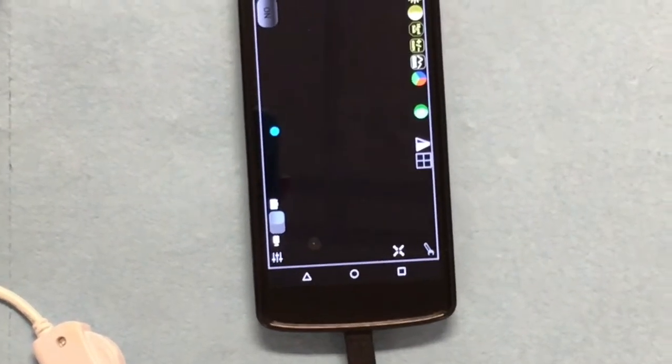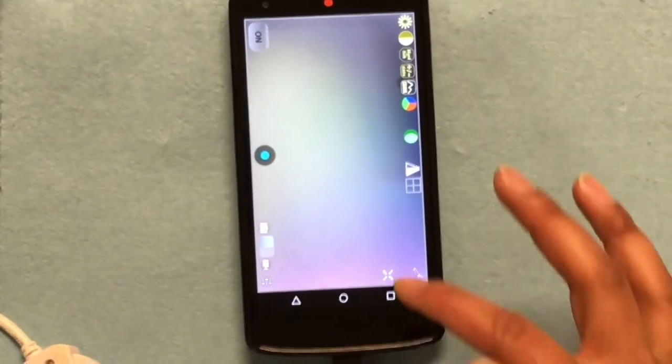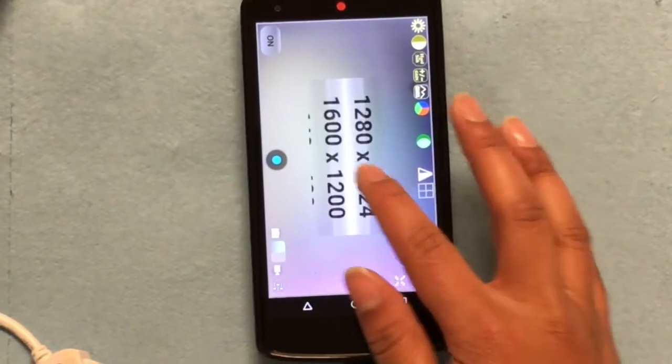Now, set the resolution by clicking on the resolution icon, which looks like an X. Select the highest resolution, which is 1600 by 1200.